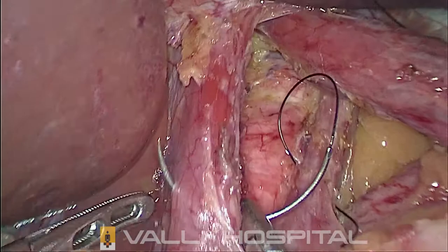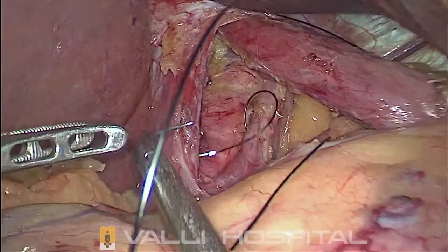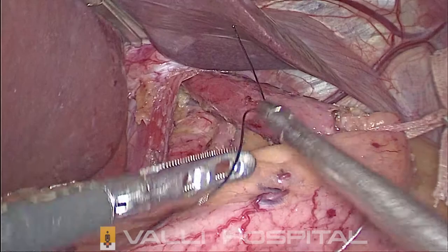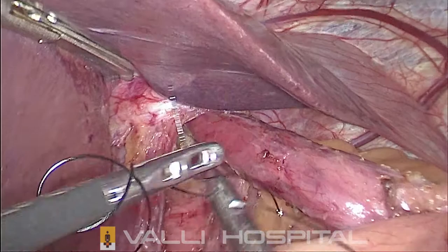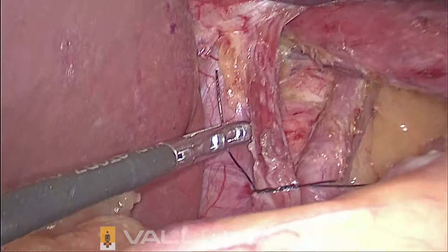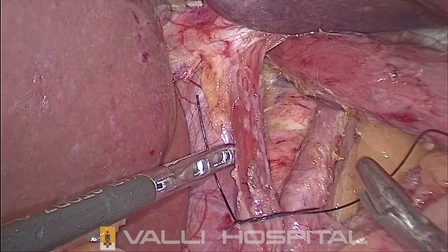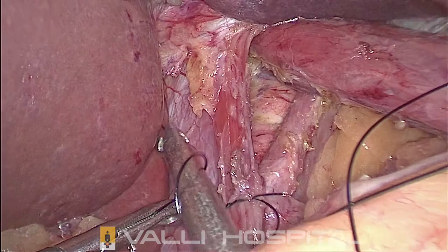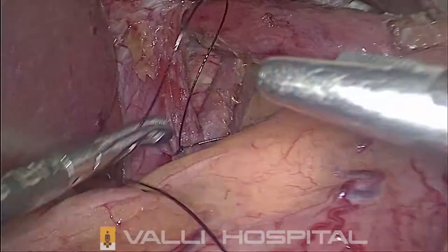While taking the needle out, you should take the needle in a horizontal manner. See, horizontally, you have to, because the space is very less there, you are likely to injure the liver. So we use 1-0 monofilament. Put a surgeon's knot, otherwise every time you have to slip the knot. If you put a surgeon's knot, the crura will stay together. Don't tighten it too much, otherwise it will strangulate the muscle. The muscle will go in for necrosis. Just approximate.